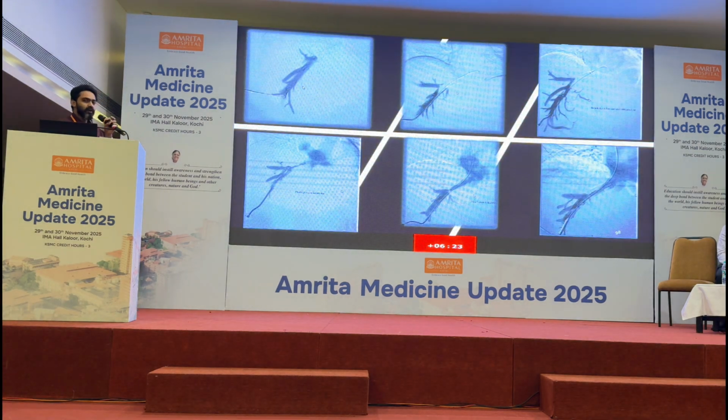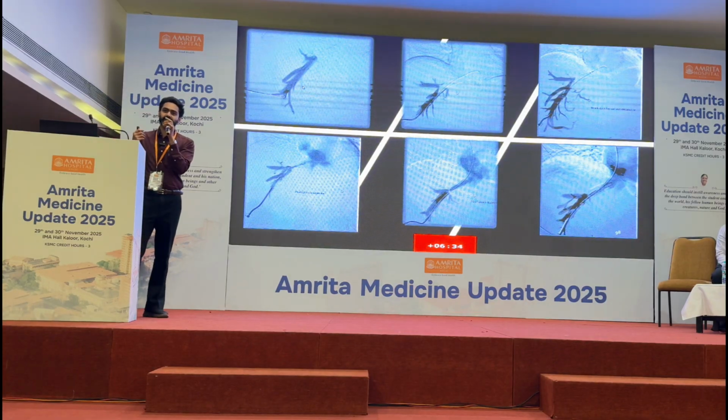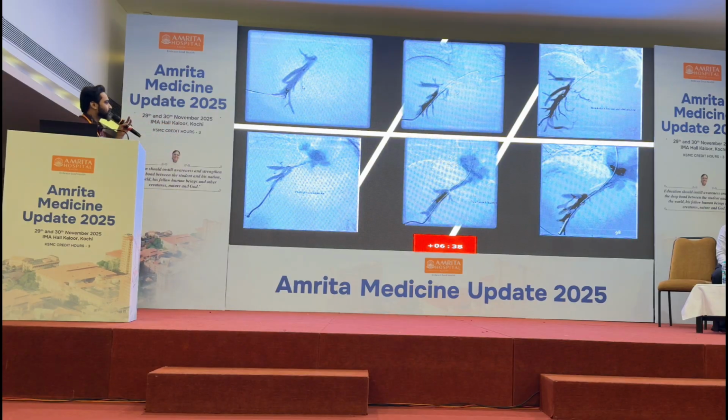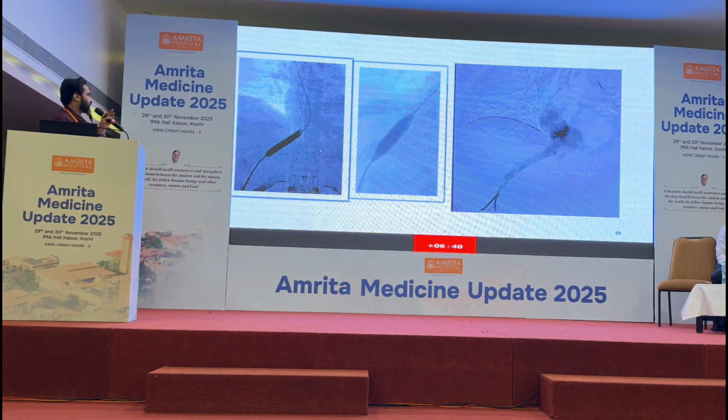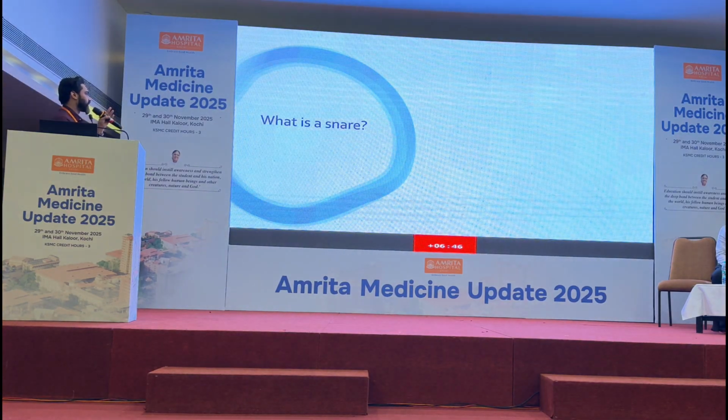The next day when we called the patient, the stent was occluded. So now what we do, along with thrombolysis, we have some gadgets like AngioJet, which are mechanical thrombectomy devices that macerate the thrombus and take it out. So we did that, and finally we placed the stent, and this is the Doppler after 48 hours, which showed complete recanalization of the occluded hepatic vein.